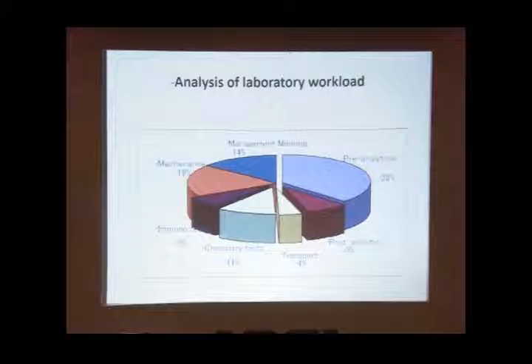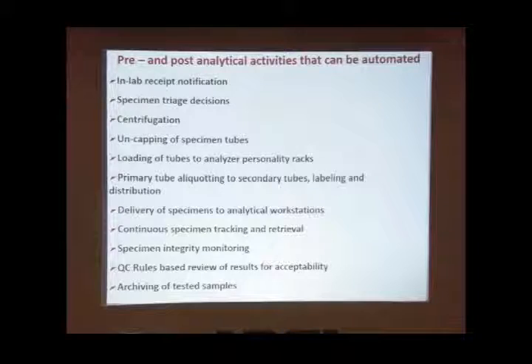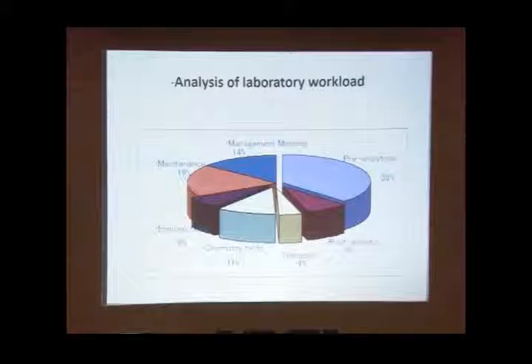Now if you take the laboratory workload, many of you would have seen, and there are a lot of studies which show that the pre-analytical phase takes about 38% of our work. Post-analytical takes about 8%.